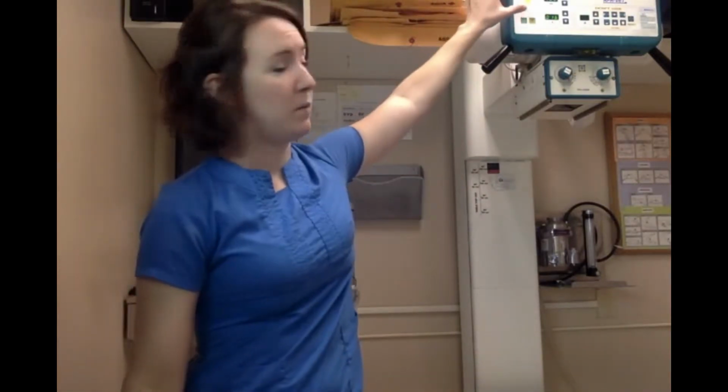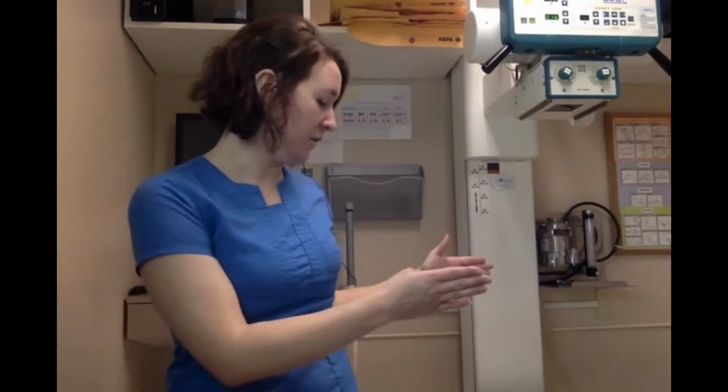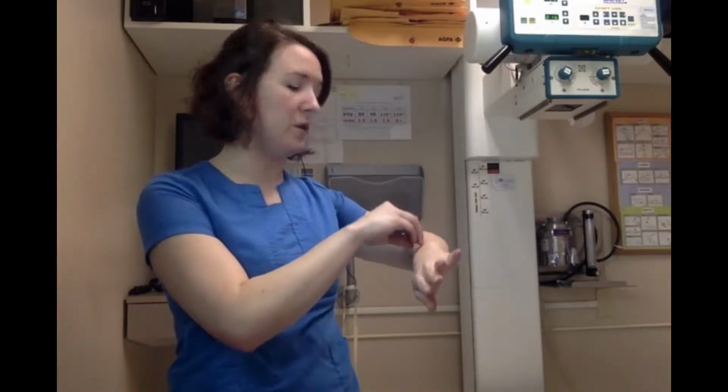And as you can see, based on the readings that we take here, we receive very, very small doses of radiation, and we do everything possible utilizing our personal protective equipment, keeping our kVp and our mA at the best level possible, and collimating all of our images in to make sure that we're only shooting beams at the areas of interest so that we don't have excess scatter radiation coming back from the patients at us.